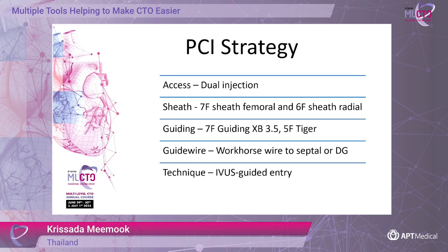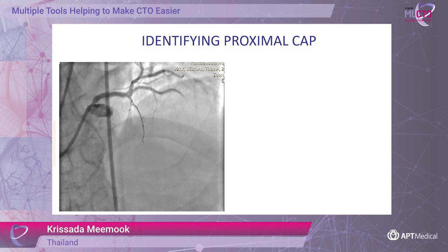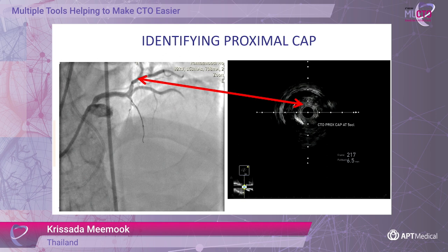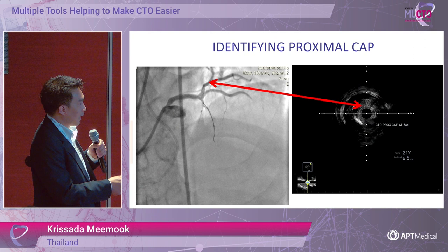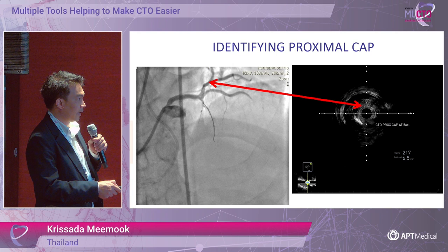This is the strategy for PCI in this case. We planned to use dual injection, using a 7F femoral and 6F radial from the diagnostic procedure, and an XB 3.5 guide catheter for the antegrade approach. First, we put the wire into the first diagonal or nearby branch, but we could not clearly see the proximal cap. Then we put the guidewire into the first septal branch and checked the angle to visualize the proximal cap. Using IVUS, you can see the proximal cap of the CTO at the 5 o'clock position — meaning the true proximal cap is here, not there.